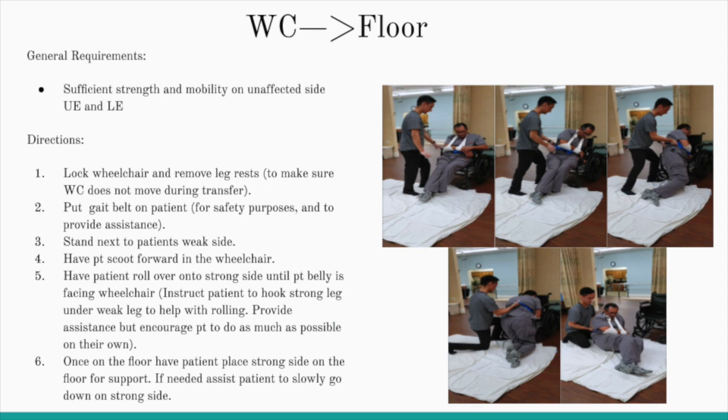Again, one thing to consider is that you will encounter patients needing different levels of assistance. It can be someone who requires a lot of help, or it can be someone who doesn't need as much help. So if you don't feel comfortable doing this transfer, you can always get another person just to help you out. And if you still think that this transfer is not appropriate, then maybe try something else like an airplane transfer or even using a Hoyer lift. But again, this is mostly for someone who has a good upper body and lower body strength unilaterally.